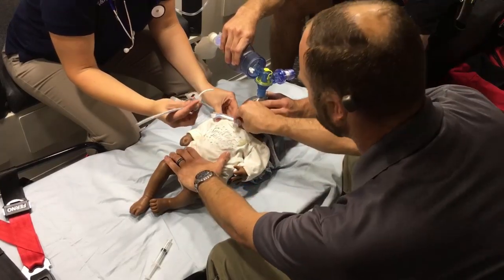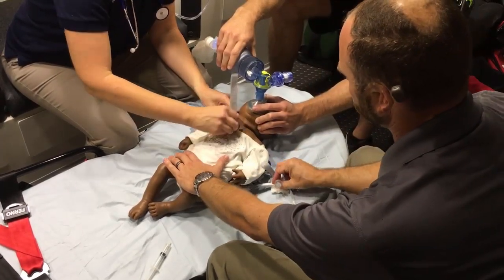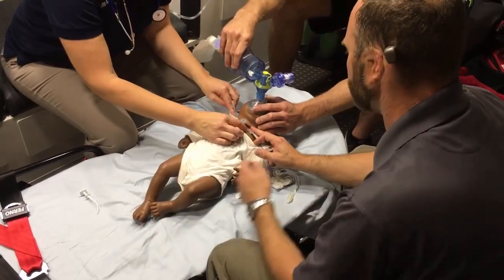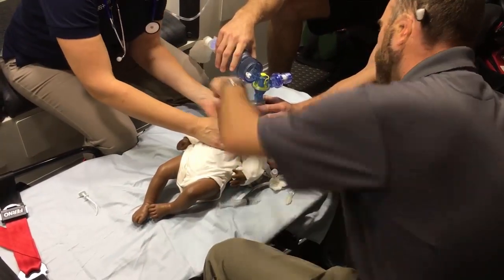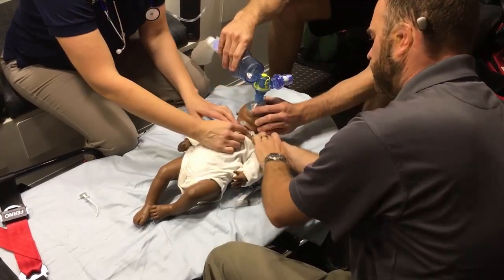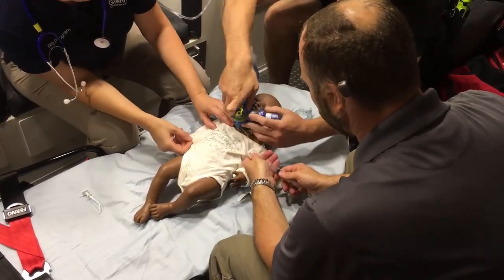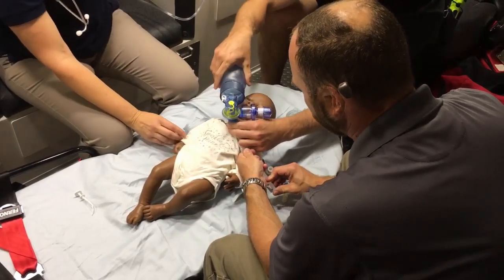On my count — three, two, one. I got the new trach ready to go. I'm passing it. I'm going to pull out my obturator. Can you get those ties secured for me? Let's go ahead and bag her right away from bag to trach. I'm going to re-inflate this with the water that came out of the old trach.